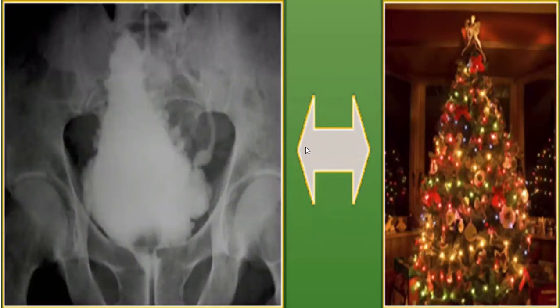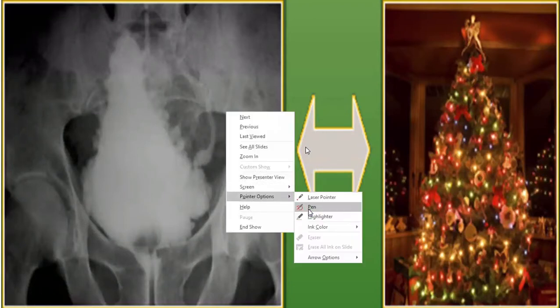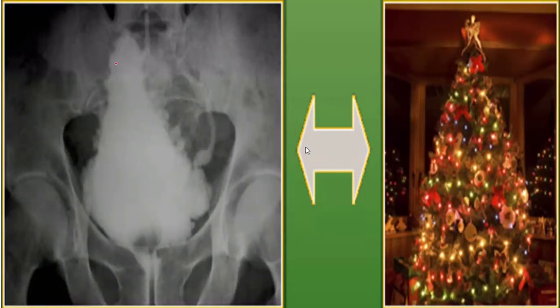So actually, this is a bonus question for you. This is a urinary bladder actually. So this is for all of you. So just wait. This is a urinary bladder. This is not the usual bladder you see filled with urine, because this is contrast filled. Actually, you injected a dye or a contrast to this area. That's why it turned white because of the contrast media.